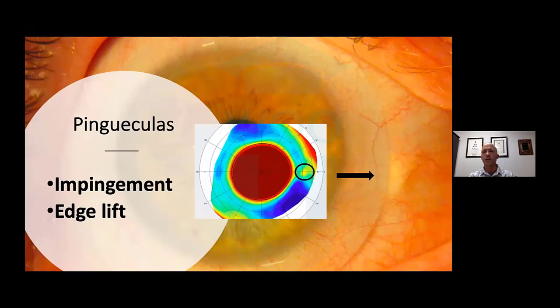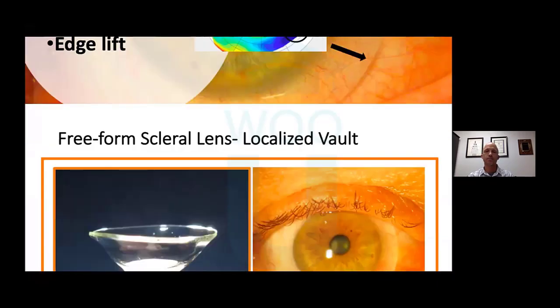In fact, right now in this photograph, he has a scleral lens with a spherical landing zone, and you can really see the impingement there. And then just below that is the steeper area; again, cooler areas represent steepness or increased sagittal height. We see edge lift. And so this undoubtedly was the problem with his previous spherical scleral contact lens design.